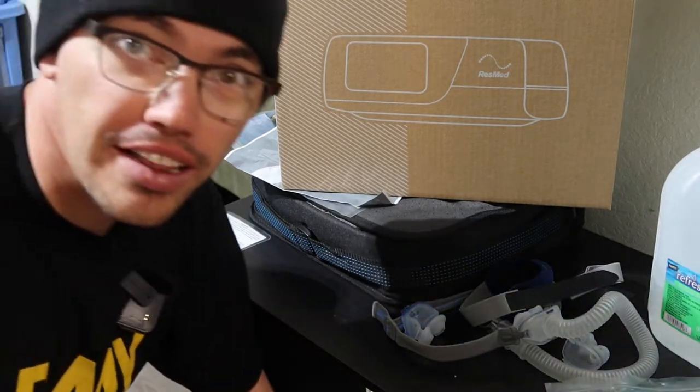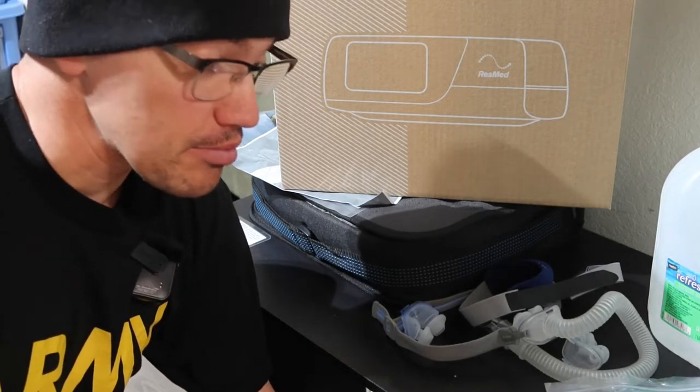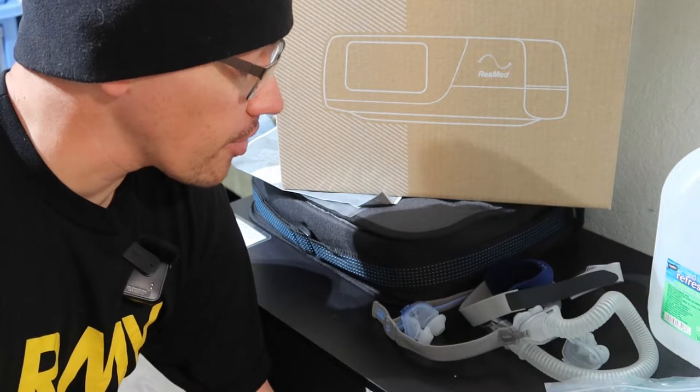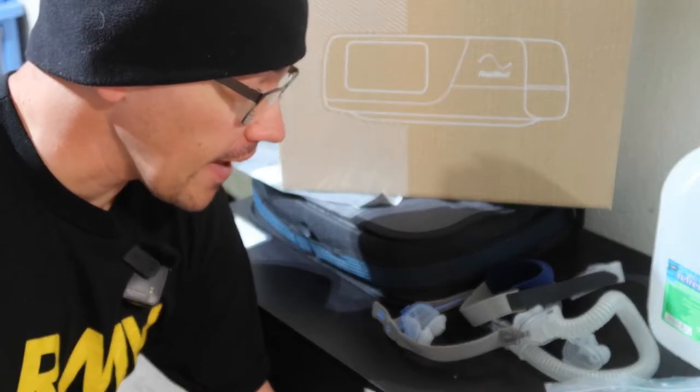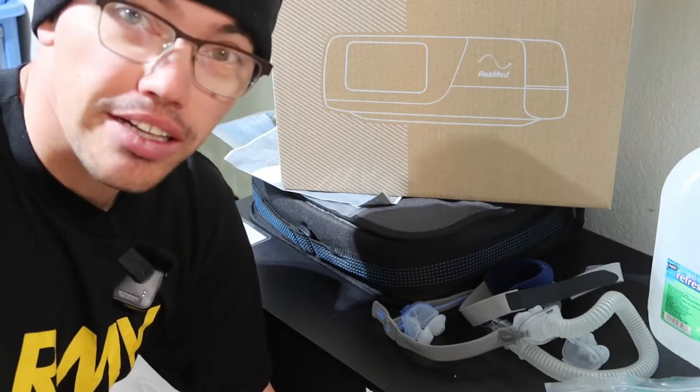Why hello! This is Hager's Hangout. I'm going to show you something I've been using for almost a month now, and people have asked me about it, so I'm going to go ahead and explain it.